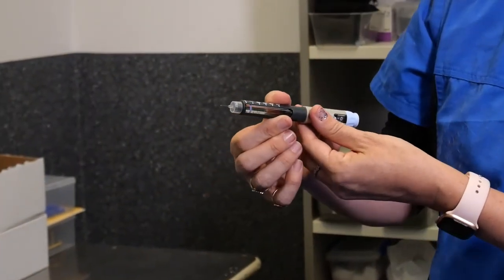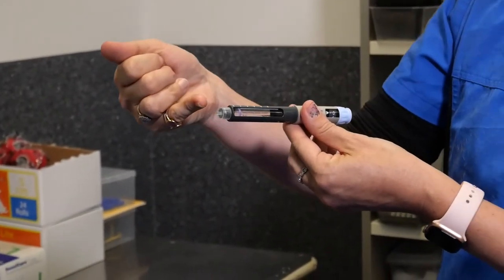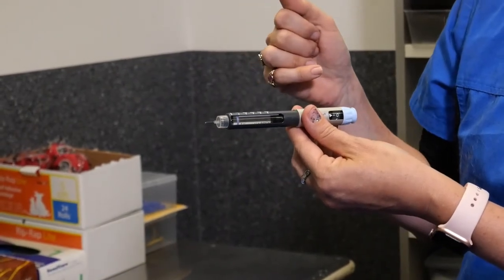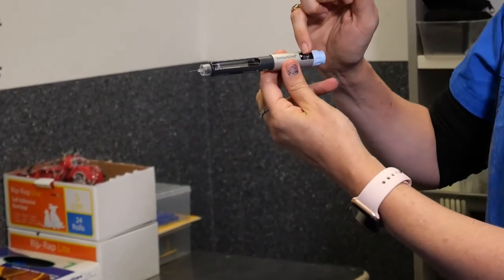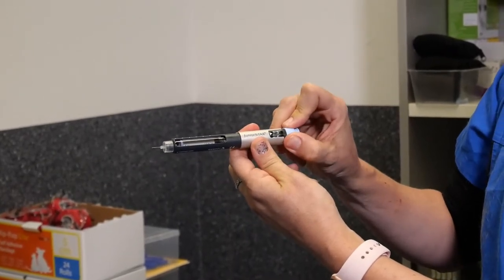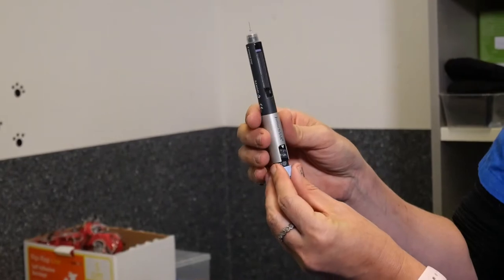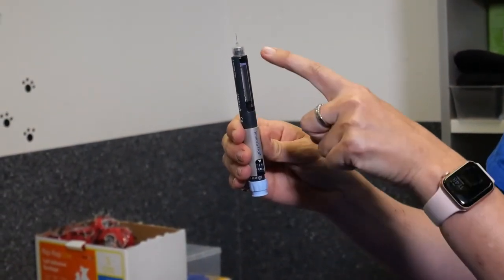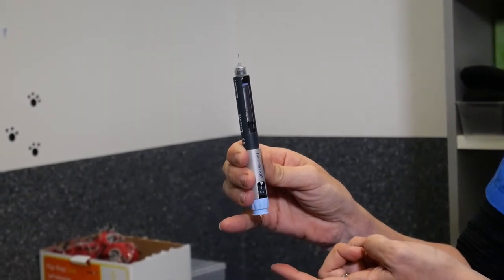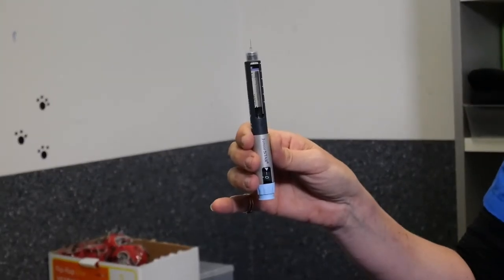We need to prime the pen every time you give your cat their insulin. This makes sure that there is insulin sitting within the needle so it's not an empty needle, which is really important when we're using such tiny dosages in cats. As you can see, you have a little dosage window, and to prime we're going to go to five units of insulin. Hold the needle upright and depress the plunger — you'll see all of that insulin come out. There'll be a little blob of insulin at the top, so just give that a shake to get rid of it.